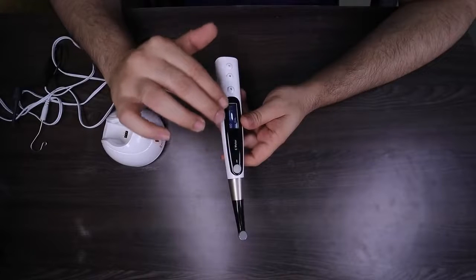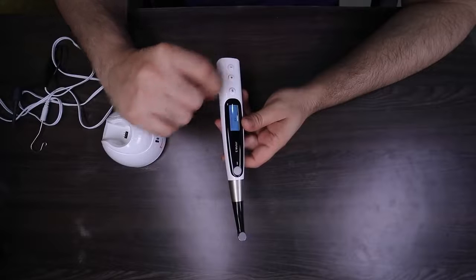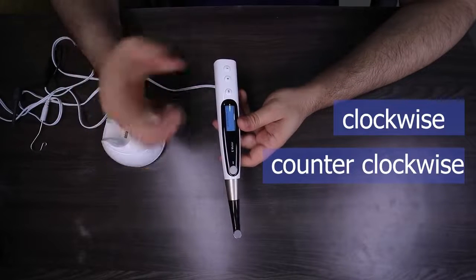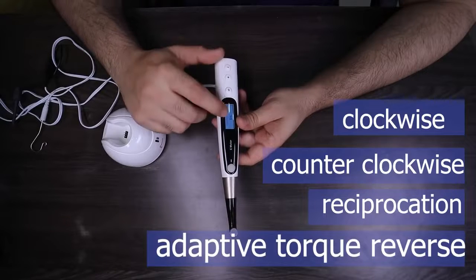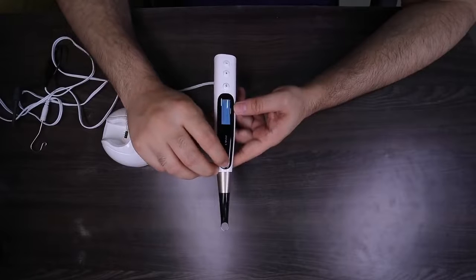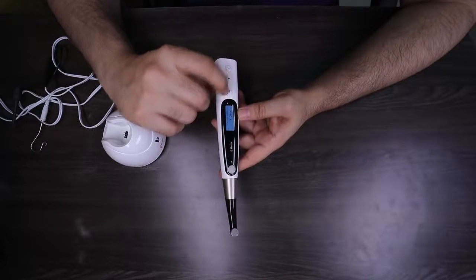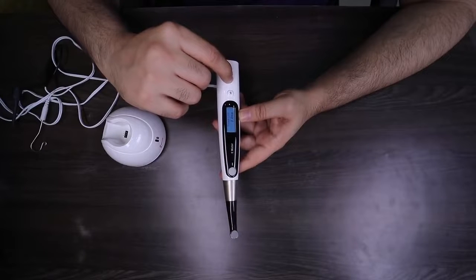M0 is the standard preset for your Apex Locator. Then you go to M1. You press the S button — the setting button — to go into operation mode. The operation mode is the rotation motion of the machine, which is a clockwise motion. Pressing the plus or minus button shifts it to counterclockwise motion, which can be used to apply your sealer or calcium hydroxide. You also have a reciprocation motion and an adaptive torque reverse. Or you can keep it preset at your electronic Apex Locator. Once you've decided your motion mode, press the setting button again and you shift to speed. The speed range is from 100 rpm to 1000 rpm — I'll select 400. Then shift to torque, which goes from 0.4 Ncm to 5 Ncm — for my file system I'll keep it at 2.2.